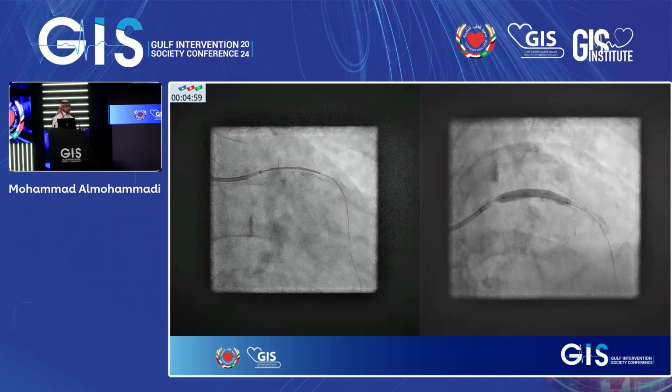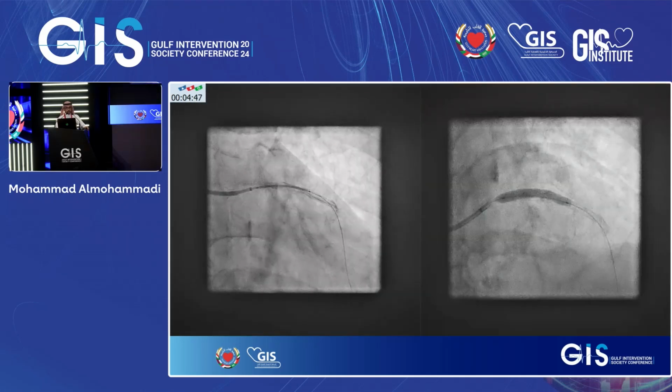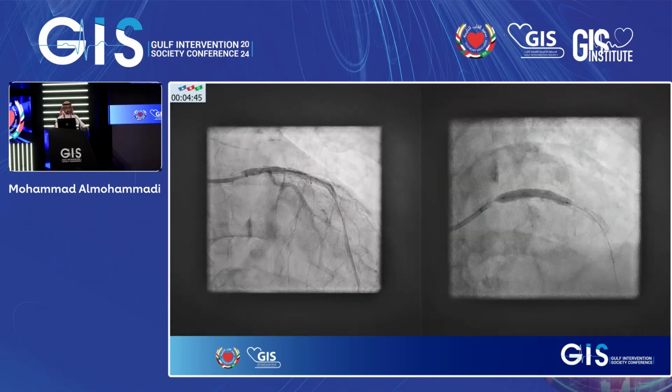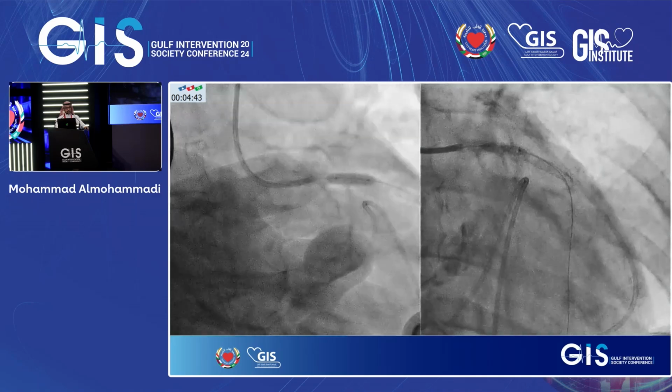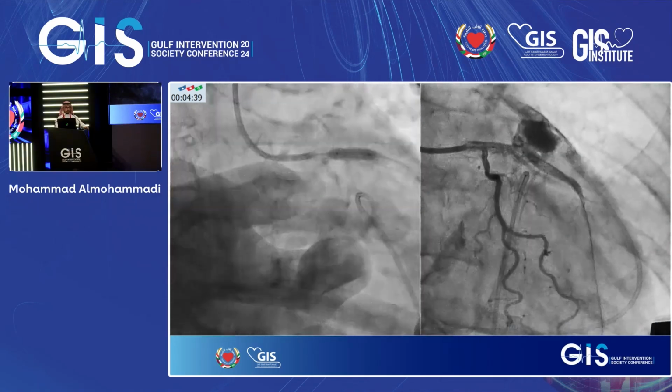And then another stent came in. And it's not a high pressure stent or anything, just a deployment at nominal. And unfortunately, the patient crashed after that. We can see here that the position looks good, but immediately after deploying the stent, we see unfortunately this view.